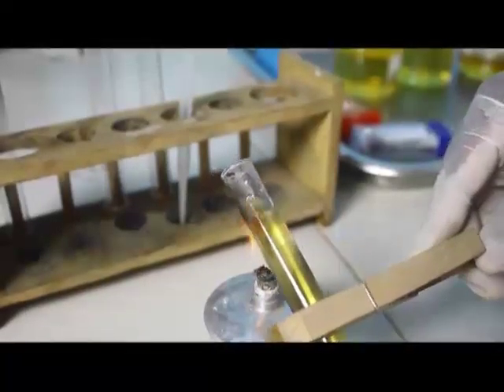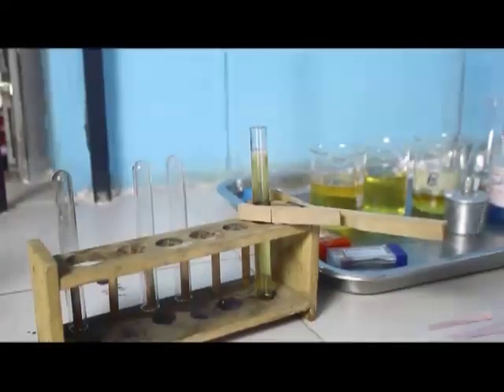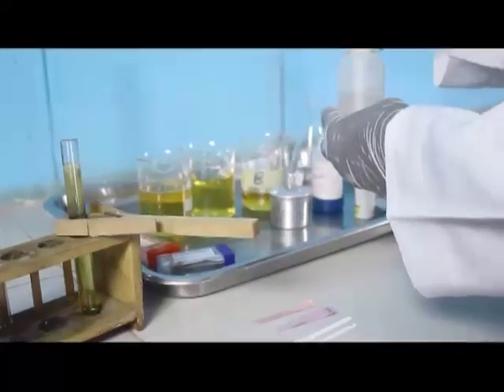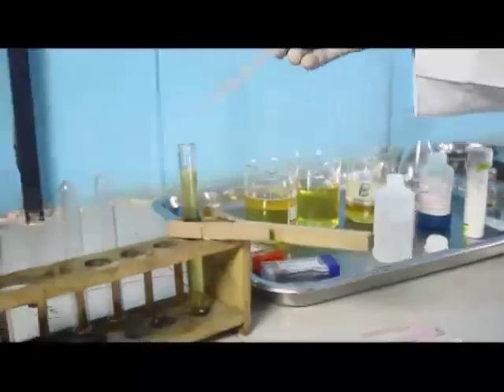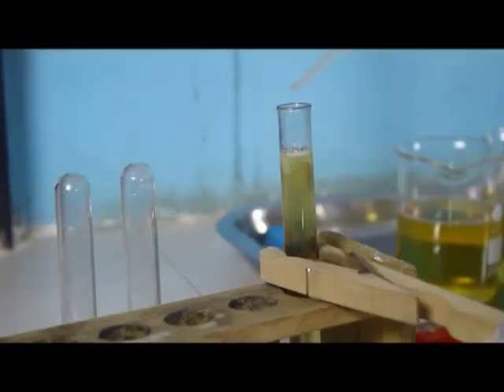If the boiled portion becomes more cloudy than the lower portion, a drop of acetic acid is added. If the cloudiness disappears, it was caused by phosphates. Such is not significant. If cloudiness remains or becomes heavier, albumin is present.